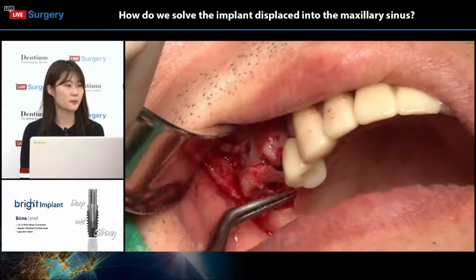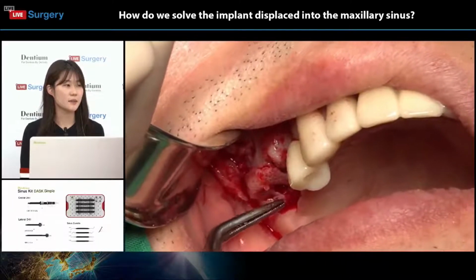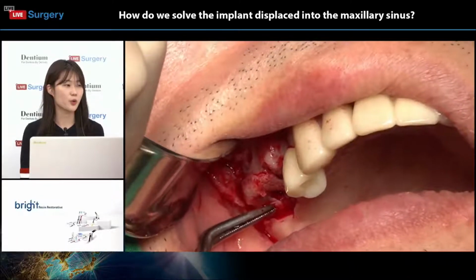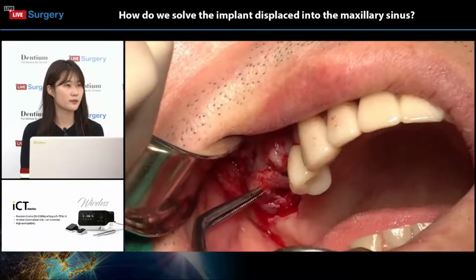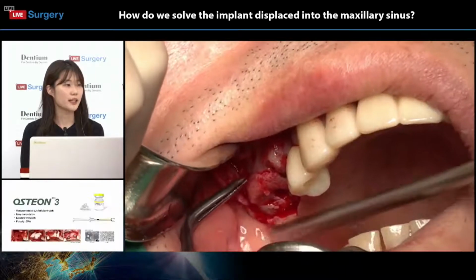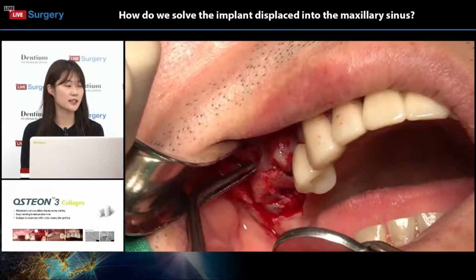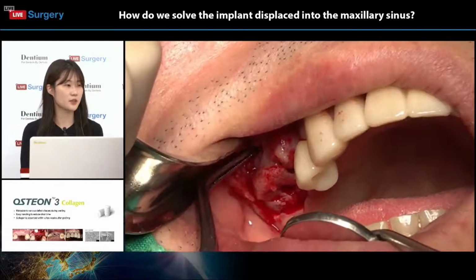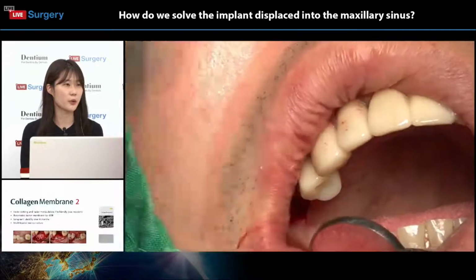We assume that their bone quality should be poor, and CBCT images showed poor quantity and quality of the bone. Superline can be a good choice in situations of this kind, since its tapered fixture is claimed to show good stability within a small amount of bone.